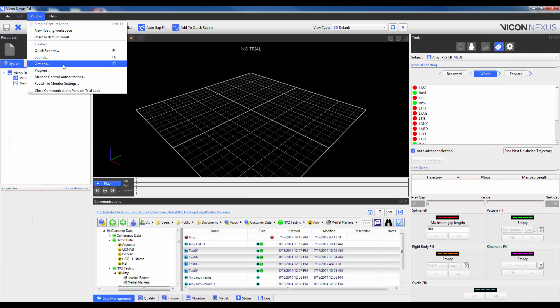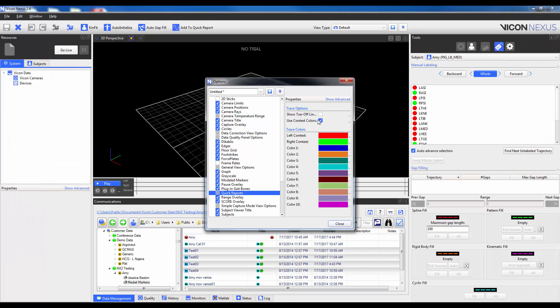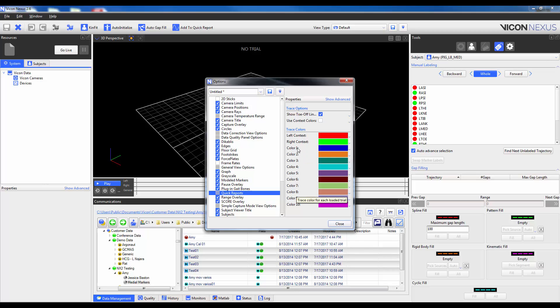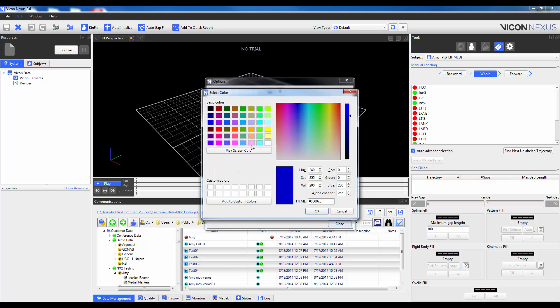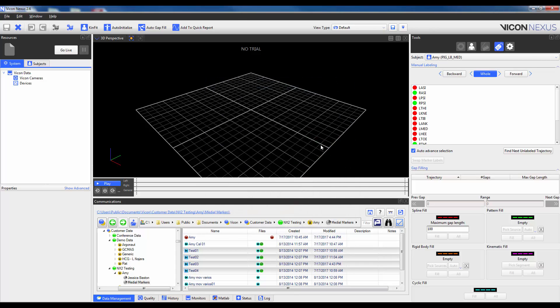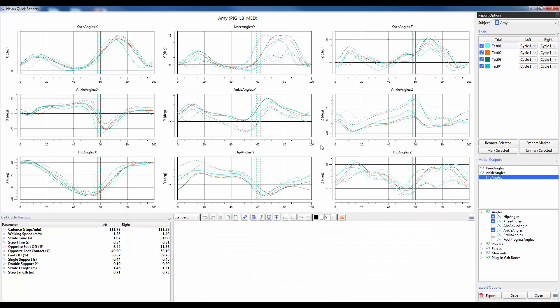Alternatively, I can also choose to, let's just turn that back on, to change the context color so they don't default to that red and green. Instead, what will happen is each trial will have a color associated based on the number of the colors shown here. So trial one will have this blue color, trial two will have orange, trial three will have green, etc. If I want to go ahead and change any of these colors, I can go ahead and click on the color and then choose from either in the color palette or these preselected colors here. So I could make this light blue as an example. I'll click OK and I'll close it and if I open quick reports, we can see that this new color scheme is reflected here.